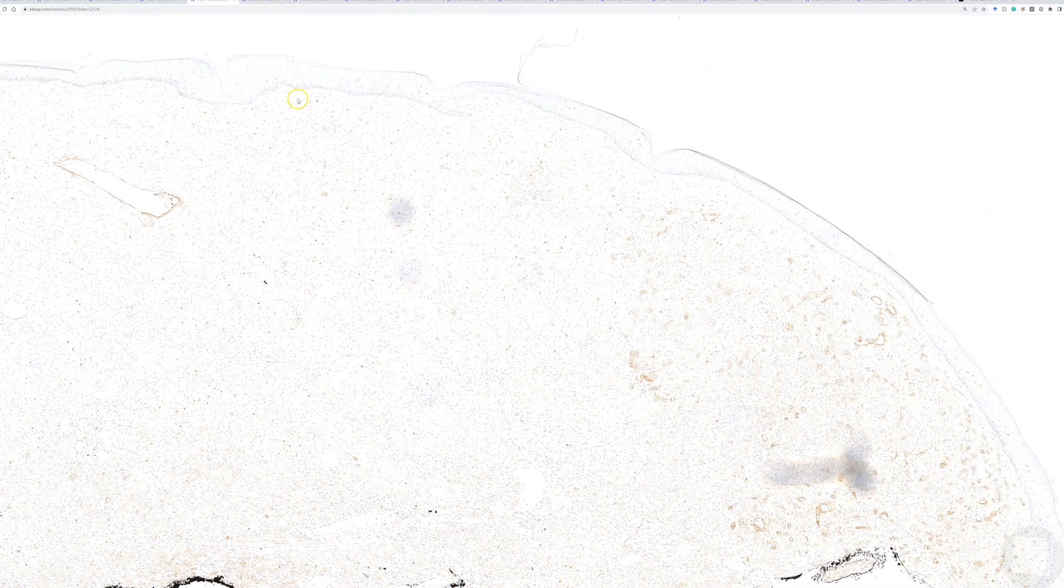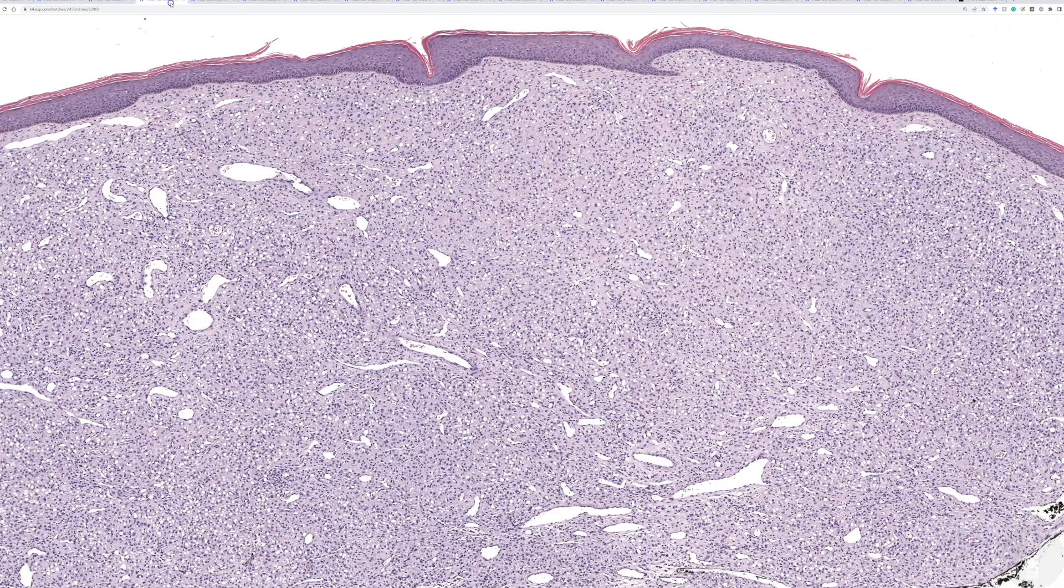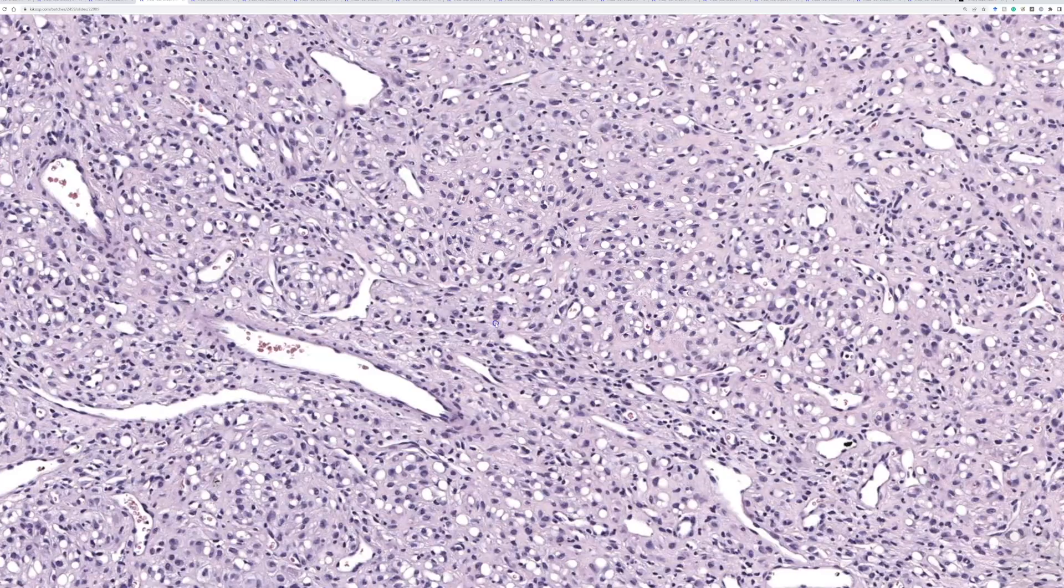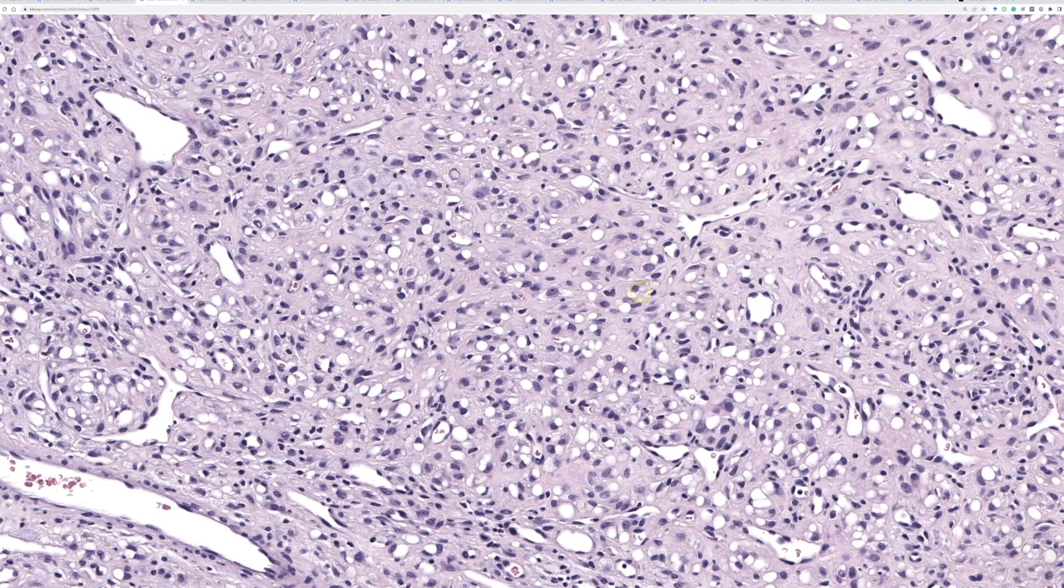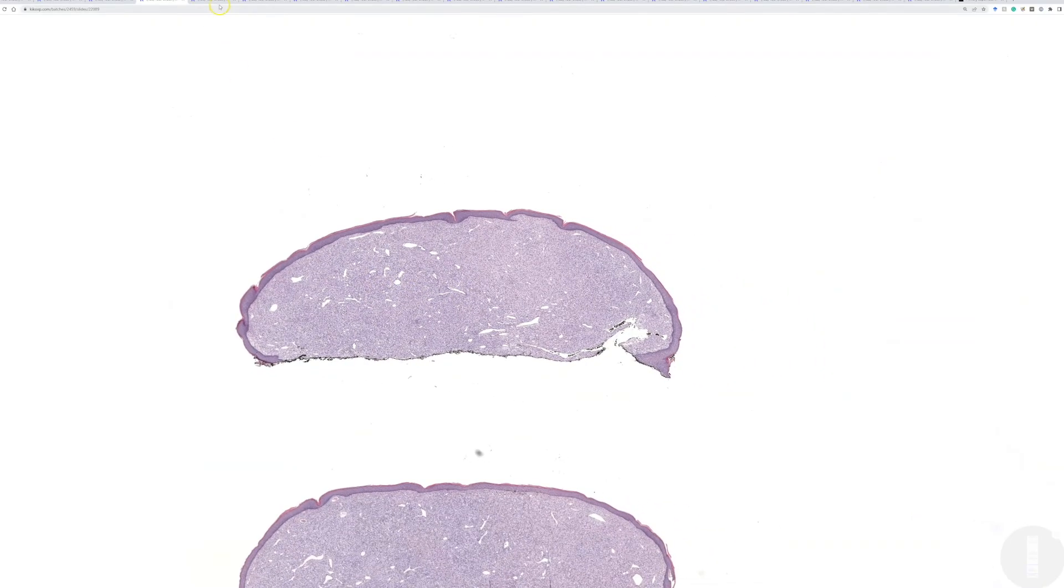Epithelioid fibrohistiocytoma, in this case, with a cool signet ring cell and xanthomatous change. I hope you liked that case. I really did.